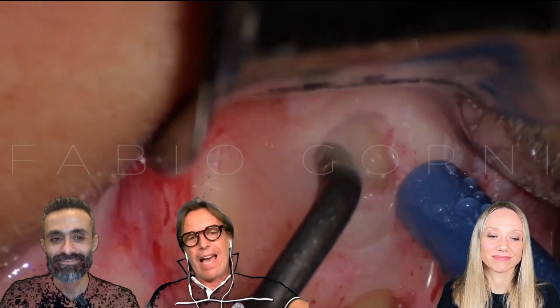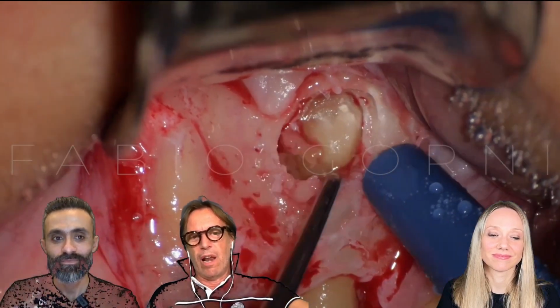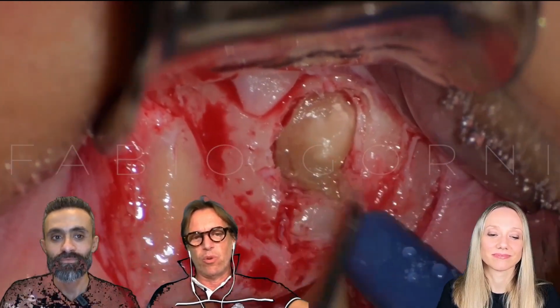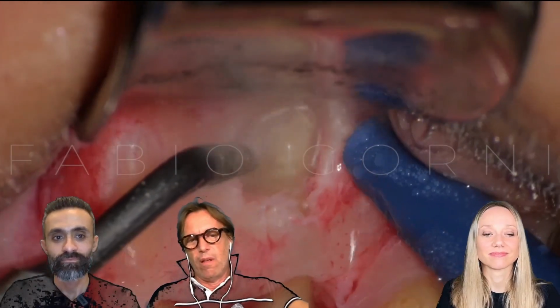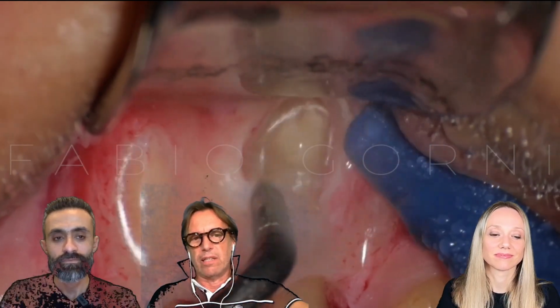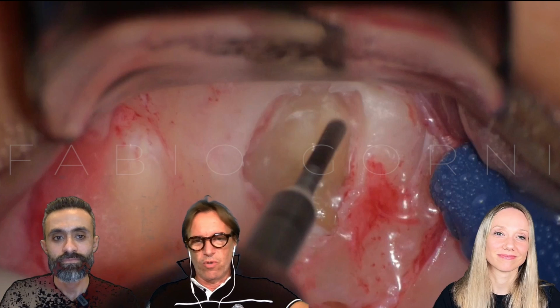In this case, I'm using the piezo surgery for a simple reason. I'm not sure that in the lateral aspect of the root we will have a portal of exit. So I don't want to resect too much of the root. So first I want to check the root, and only when the check is completed, I can decide on the apical resection. This is one of the reasons, in my opinion, the guided surgery is not so useful.